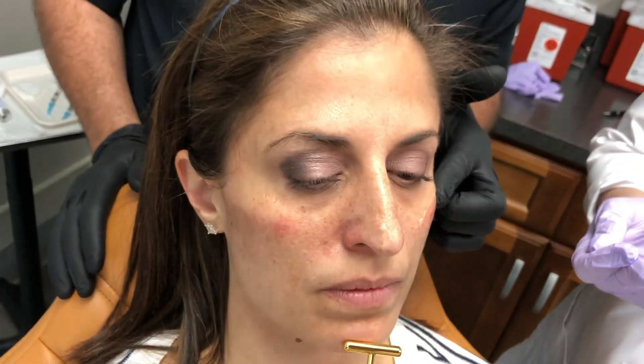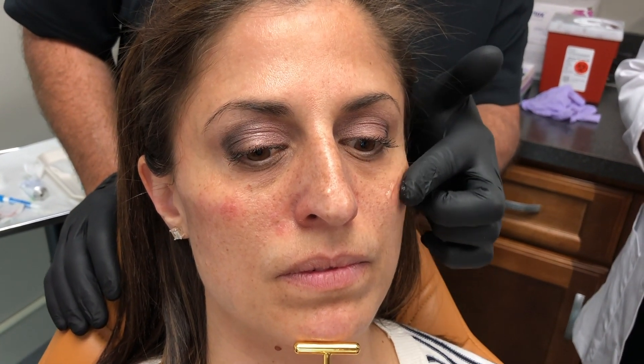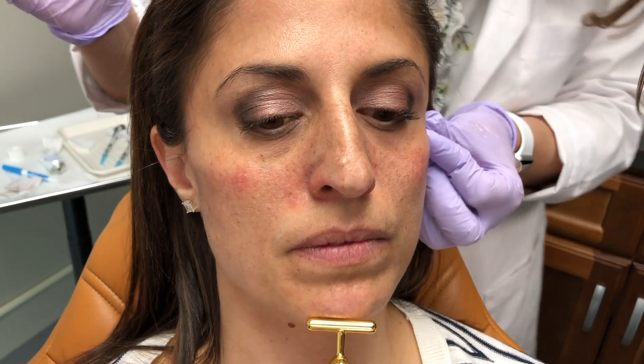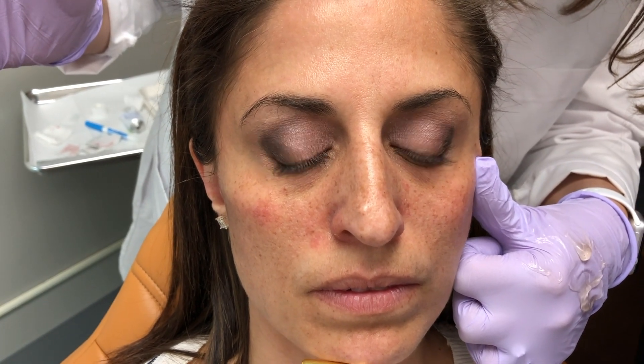Now let's show you how we're going to manipulate this and really smooth everything out. Whenever you put in any kind of filler you are going to have — I hate the word 'lumpy' but you're going to feel a little bit where we put some in and where there might be some dips. Jill is now going to manually manipulate this a little bit using arnica ointment, which gives you a good feel and is anti-bruising. She's not pushing this down — she's really trying to blend all of this together. Blending is a great AAFE word — that's what we're trying to do with that filler.